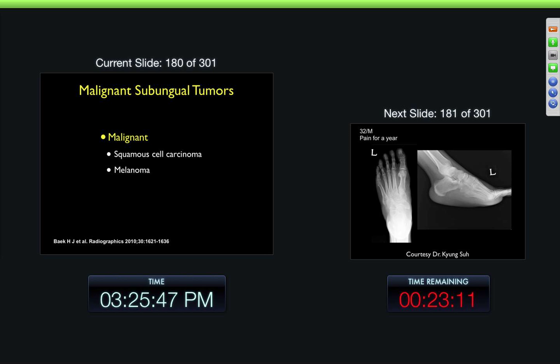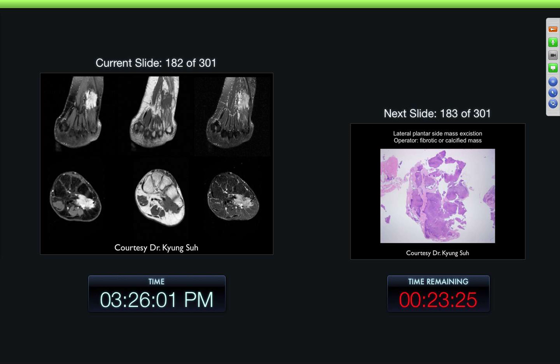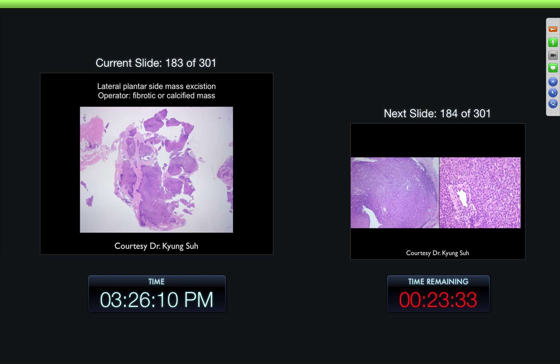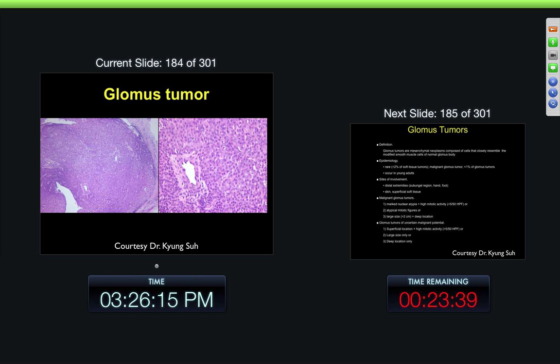Malignant lesions in this location are very uncommon. You can get subungual carcinomas and melanomas, but they're very, very uncommon. 32-year-old pain for a year. Here we can see a kind of spiculated-type mass with very irregular margins. A lot of round cells through it, and this was a glomus tumor. They typically occur in young adults — most are benign, some are malignant.